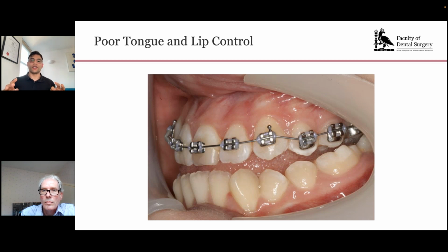And what that means is that you're more likely to capture absolutely everything that you want and then crop it down and get rid of the extraneous information that you don't need, rather than try and take a photograph of exactly what you want. And then if things aren't aligned properly, or you feel like you've just missed a bit of detail, you've lost your opportunity because that information was never captured in the first place.